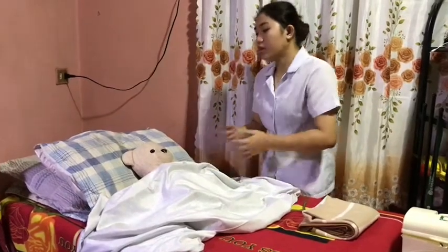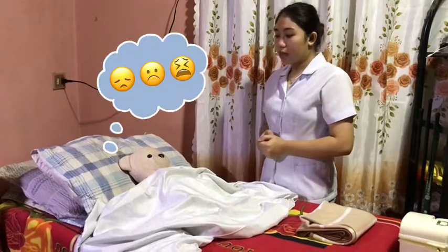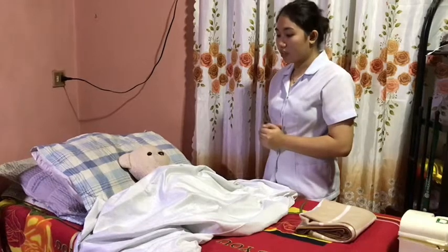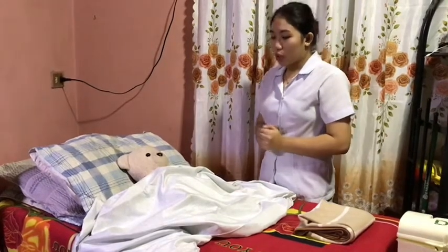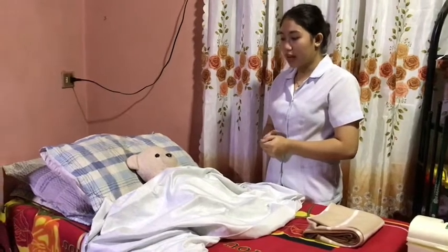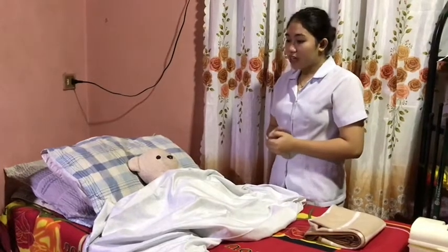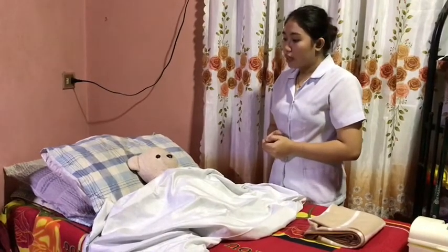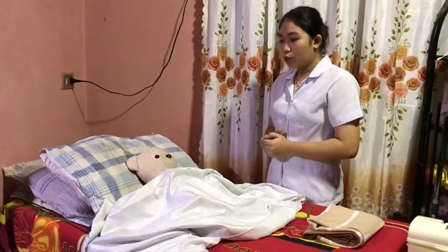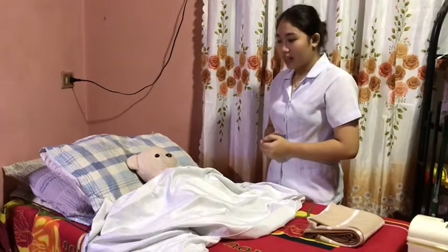Okay, thank you. So, ma'am, I understand that you have a problem in urinating, so your doctor, Dr. Ong, ordered a urinary catheterization. So, what I'm going to do, I will insert a tube through your urethra going to your bladder to excrete your urine. Later on, during our assessment, you will feel a little bit itchy and uncomfy. But after our assessment, you will feel relief.